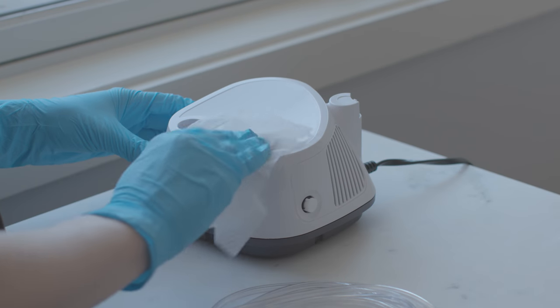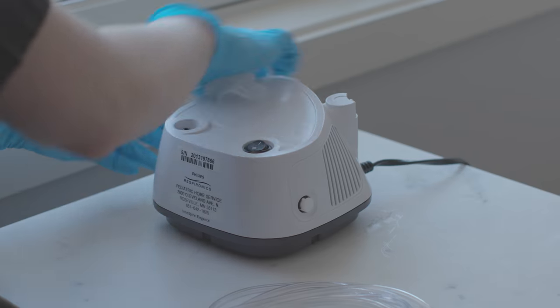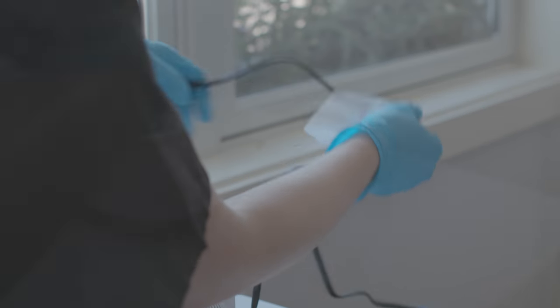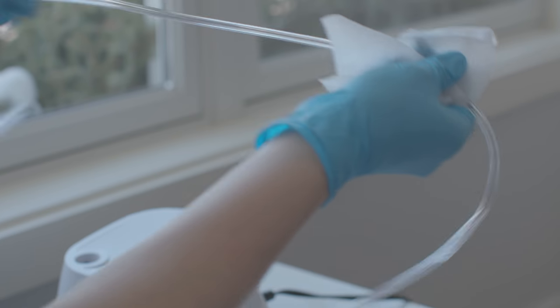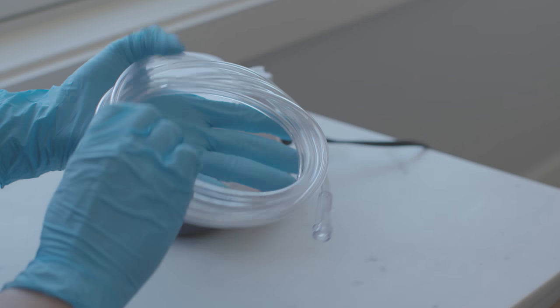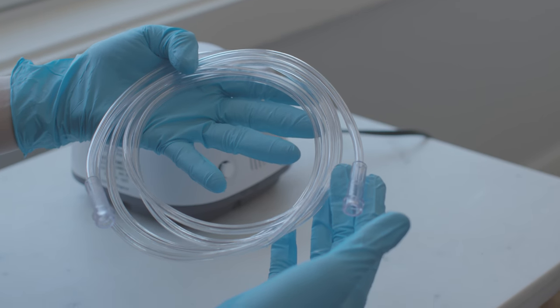Wipe the neb machine, power supply cable, and neb tubing with a cleaning cloth or disinfecting wipe as needed. Do not put these items into water or a cleaning solution. Replace the neb tubing if it is cracked or as often as the patient's care plan indicates.